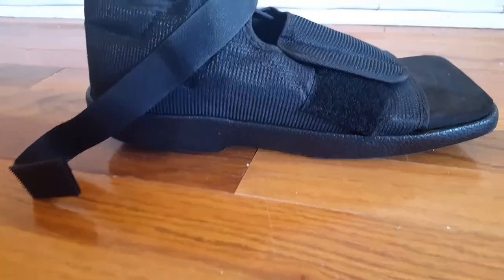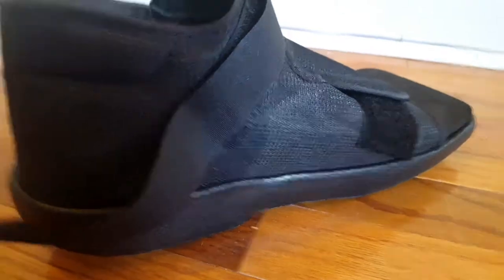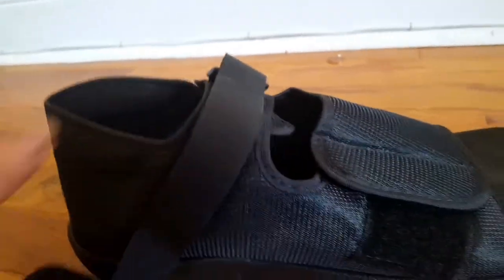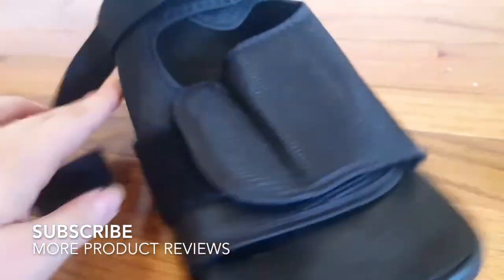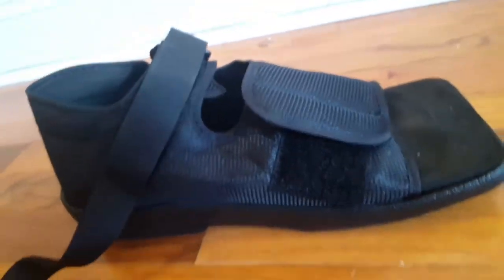This is by Mars Wellness. It's a black shoe with velcro straps. I'm not a big fan of velcro — I just don't like the sound, I think it's awful — but I don't really have a choice because it's my foot and the doctor says so.